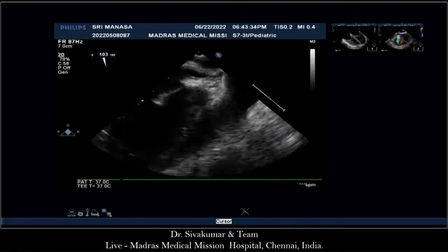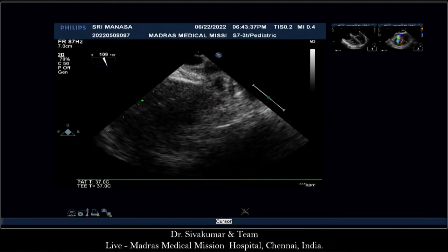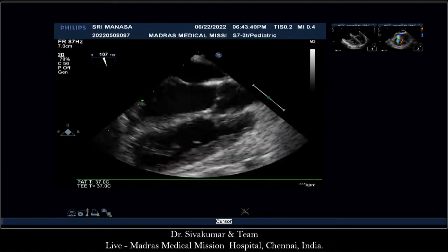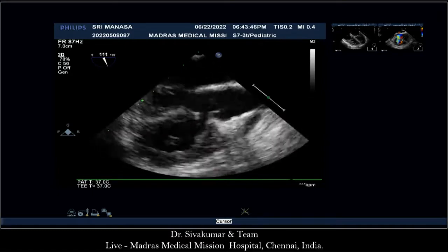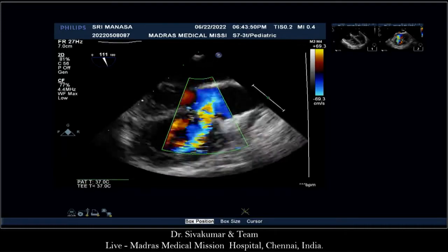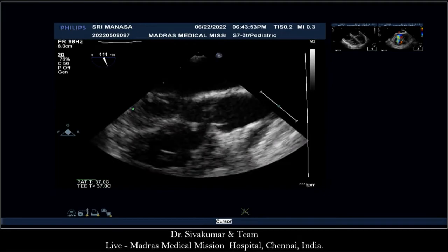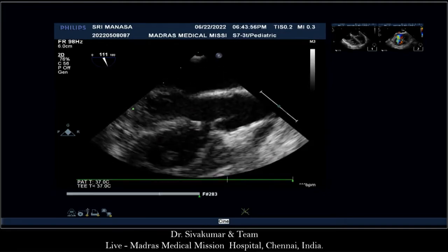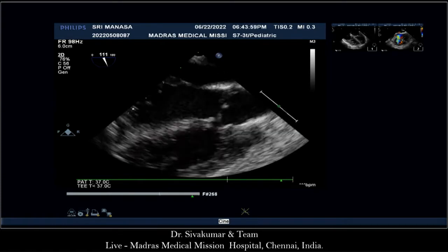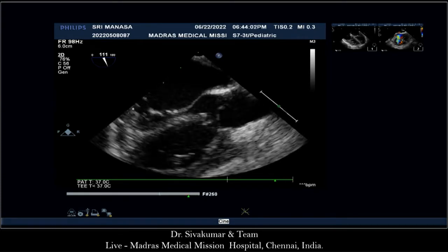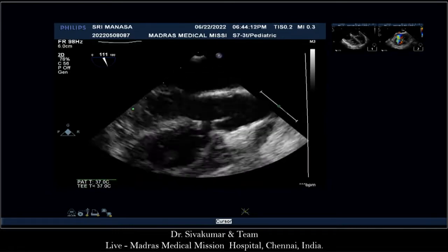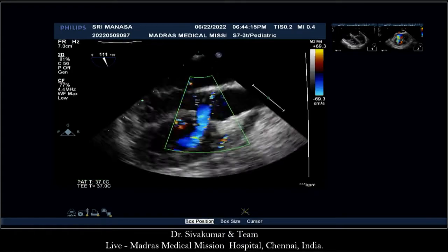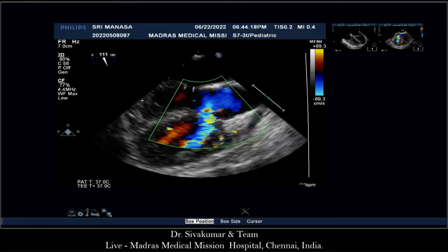In the long axis, the VSD is located beneath the aortic valve. There is no cusp prolapse. There is no aortic margin — it is roofed by the aortic valve. This is a perimembranous VSD without any significant aortic margin, almost hugging the aortic valve. There is a trivial trickle of pre-existing aortic regurgitation.